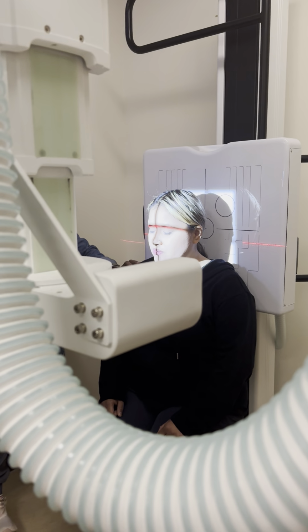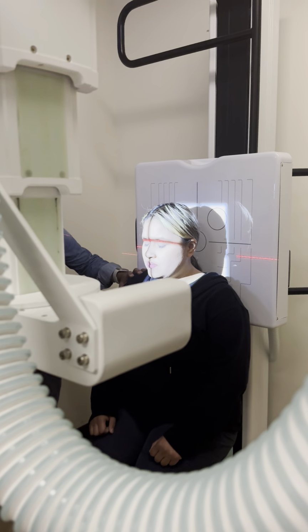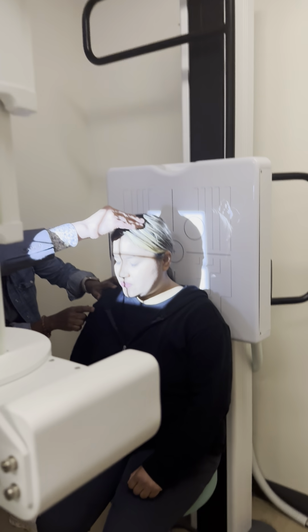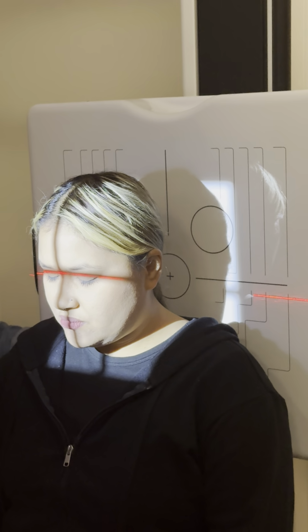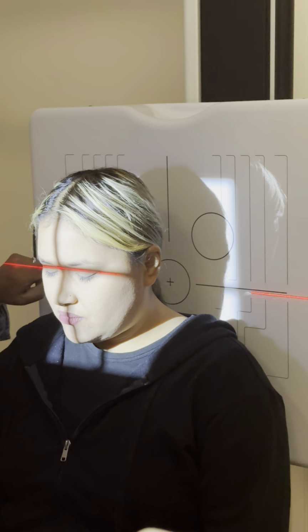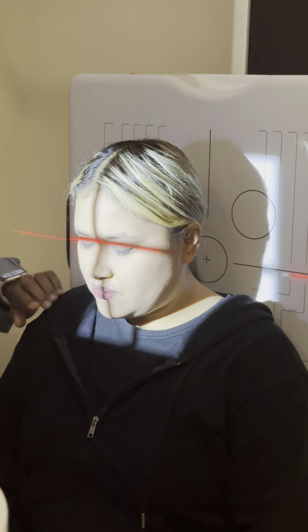What view is this? This is the AP axial Caldwell. We're going to have her tuck her chin down so the orbitomeatal line is there, at the outer canthus. That's too much. We're going to exit the Nasion. Drop the center ray down. Are we using more Nasion or here? Nasion. Okay, this is the Nasion.